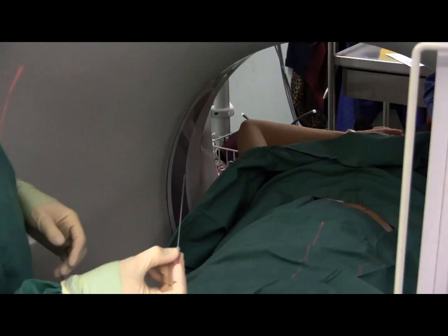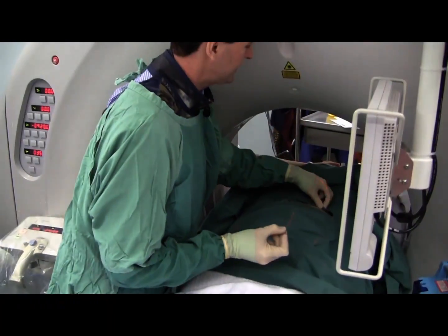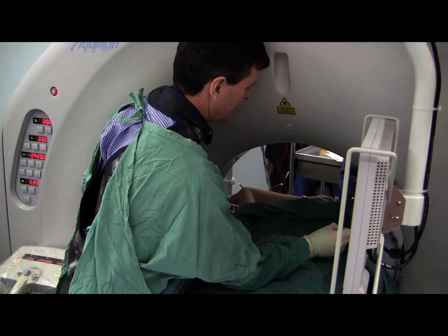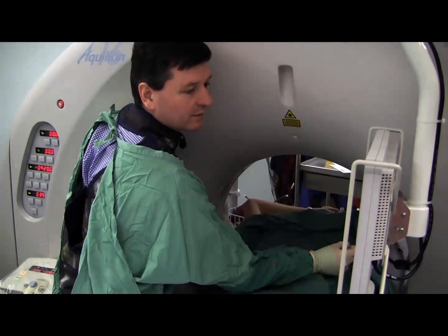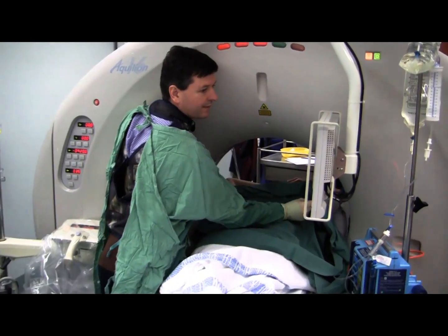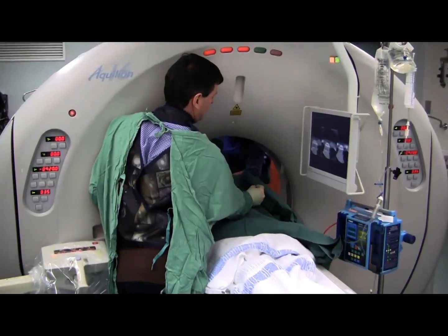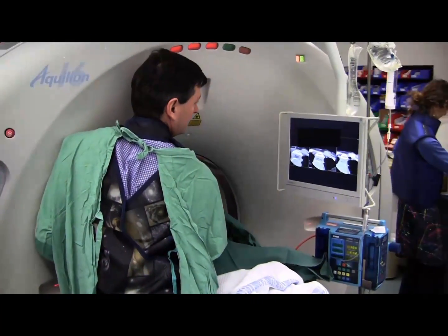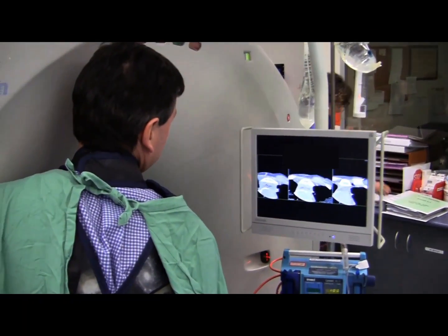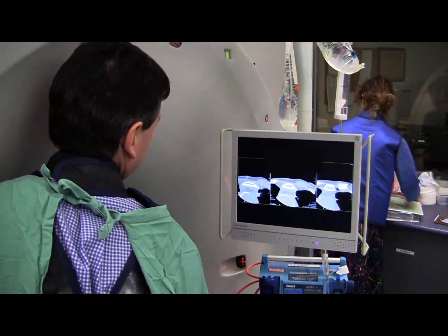So we're now ready to start placing the needle. This is the trickiest part of today's procedure. Having chosen a trajectory, now our mission is to make it all happen. Coming in quite steep. It's got a wider window. Take it out to about 1500.